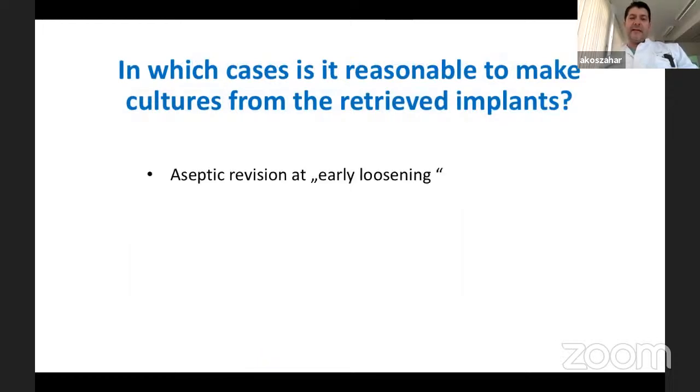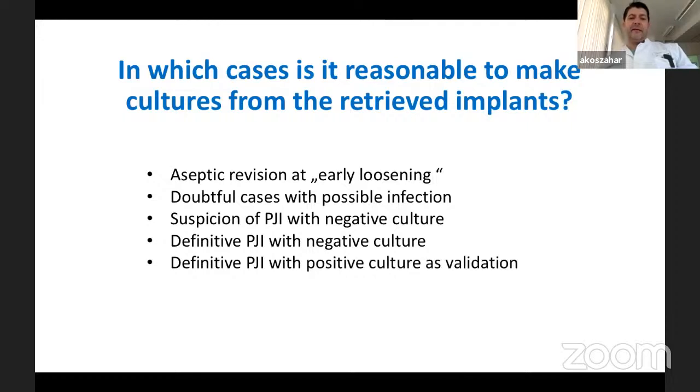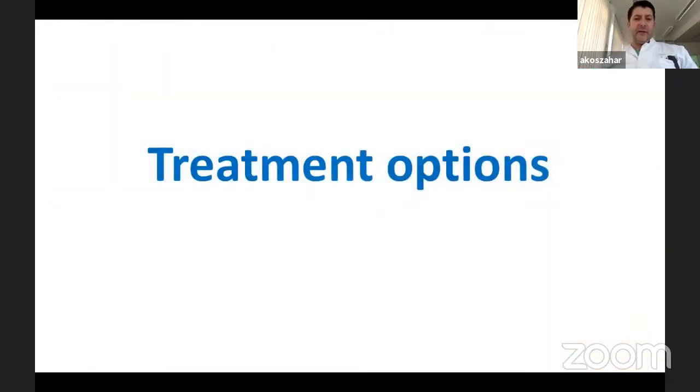So when you have cases like this, it is reasonable to go for culture from the retrieved implants, because there are some bugs you can only detect from the biofilm on the surface of the implant. In doubtful cases, you go for this. Then you have the possibility of sonication. Sonication is a method where you put the whole implant into a water bath and release the biofilm from the surface with an ultrasonic device. Then you can detect 99% of the germs. You retrieve the implant, put it in a sterile box, and send it to the lab. This is an option that we use in Germany for detection of the bugs.